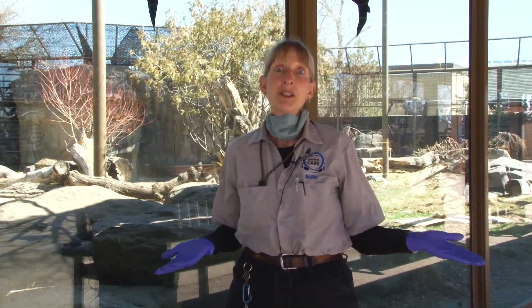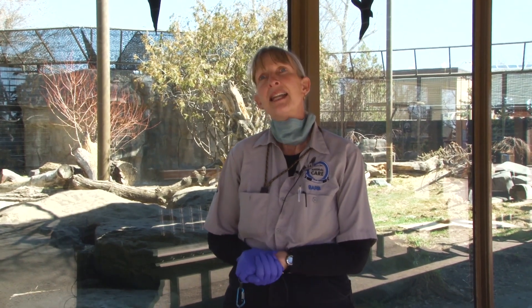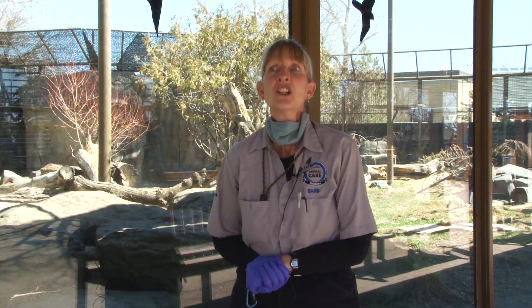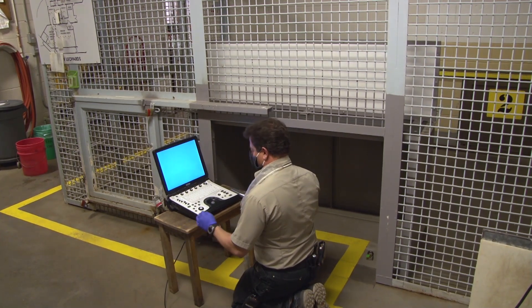Hi, my name is Barb. I'm lead keeper in Eurasia. Today we are going to be doing an ultrasound on our female Laika. She's a snow leopard. They bred earlier this year at the end of January and we suspect that she's not pregnant, but we want to confirm this. So our vet, Dr. Whiteside, is going to be coming to do an ultrasound on her.